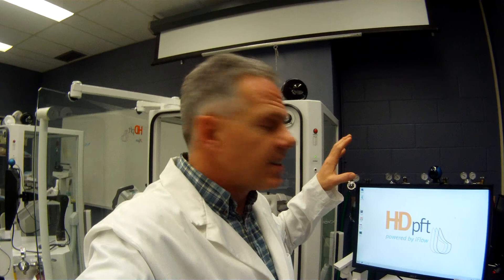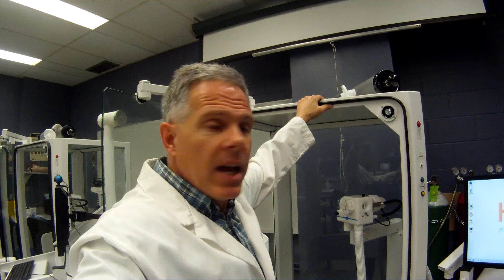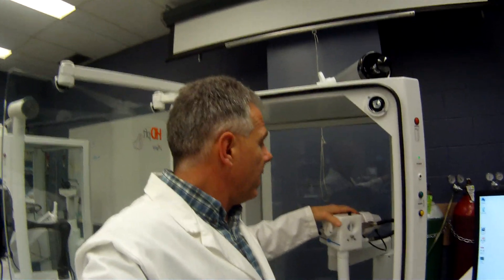Hi, my name is Alan Prost and I'm here to introduce you to the HD-PFT-4000. This unit is a little bit different than the portable units, even though it's operating the same software, because this one's attached to the body box and it has the capability of doing a nitrogen washout, a DLCO, single breath nitrogen washout, and the body box — plethysmography.